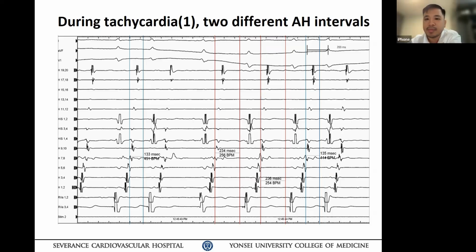Yeah. But in this case, we didn't see any AV node reentry tachycardia before ablating the left lateral bypass tract. I didn't see any report regarding this issue, but I wonder, after eliminating the left lateral accessory pathway, whether electrotonic conduction to the AV node by V pacing, in other words VA AV node conduction, was facilitated by ablating the left lateral accessory pathway. This is my hypothesis. What do you think?